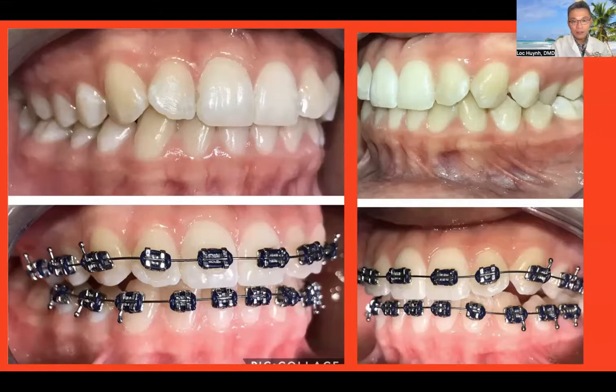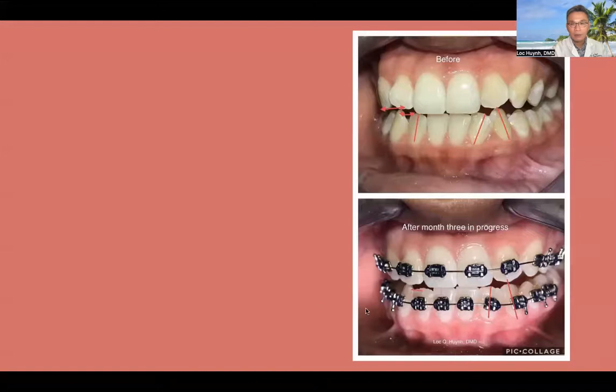How do you do that? You go through the ortho training program. They will teach you how to place the brackets, and once you put the brackets at the correct level, you will see the discrepancy of the occlusion, and that's how you can identify the problem.